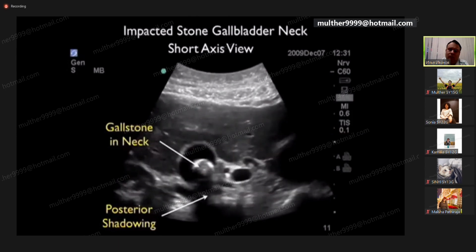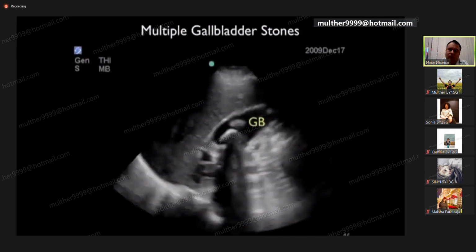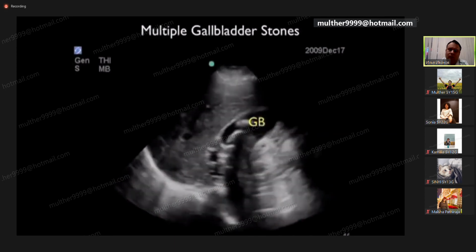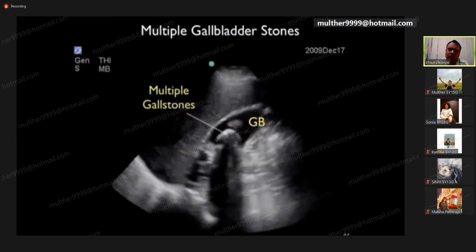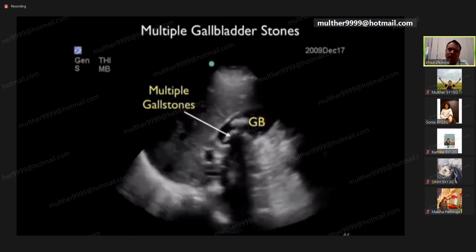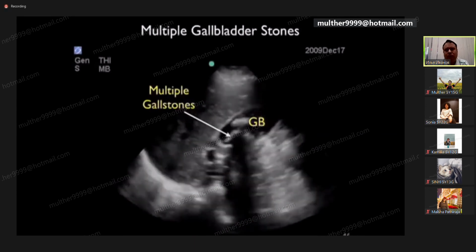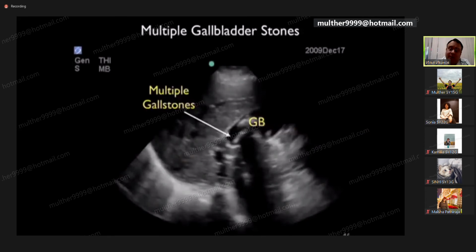Here's a video clip taken from an elderly patient with acute right upper quadrant pain. We're scanning back and forth through the gallbladder. This view is taken from that lateral intercostal view. And we see here the presence of multiple shadowing gallstones within the lumen of the gallbladder. So the end result of cholesterol deposition. But these big stones are not the problem for us, except in two situations, except the development of Mirizzi syndrome and Bouveret syndrome. I will explain this material later.